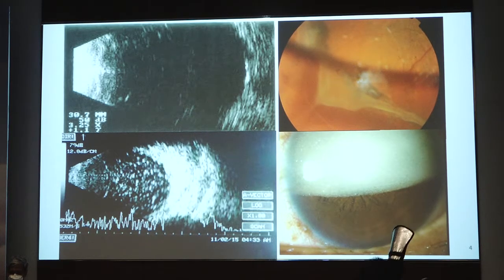Your measurement of the axial length is again compromised by the slowness of sound in silicone oil. In addition, if you're operating too late in a patient who has had the silicone oil filled for too long, you will have emulsified silicone oil and multiple interfaces, which again impedes the measurement of your axial length. You may have a suboptimal silicone oil fill where there is a space between the posterior meniscus of the silicone oil and the surface of the retina, where your axial length measurement may not be optimal.